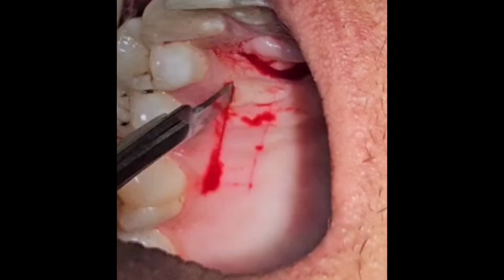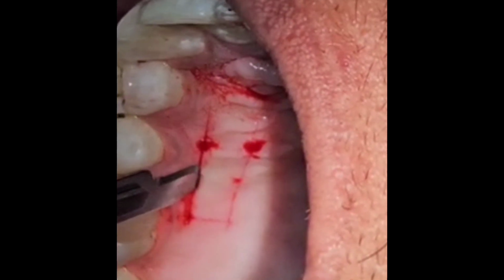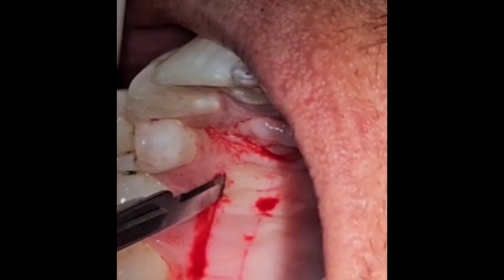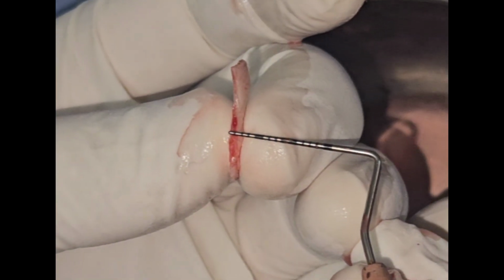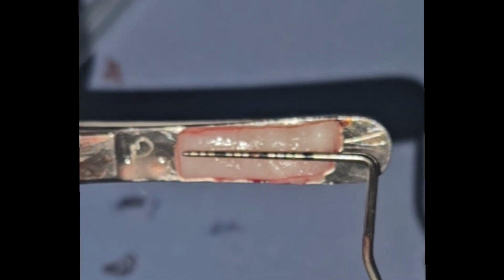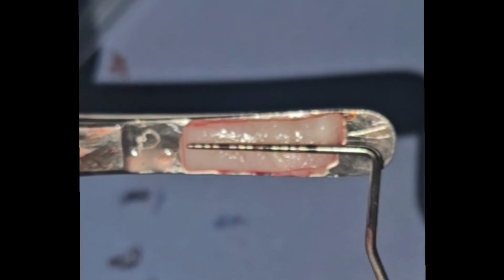from the apical area towards the center, trying for a uniform thickness of around 1.5 to 2 millimeters. One can do the intraoral deepithelialization using a burr, and once the tissue is harvested, we confirm the thickness as well as the length of the graft that is obtained.